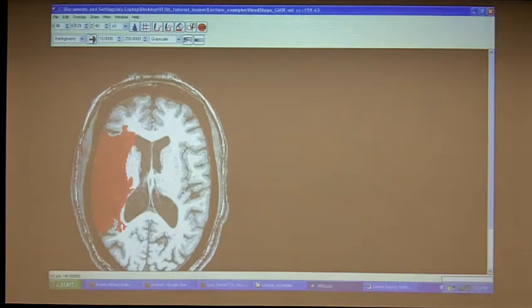But again, it really depends on how extensive the spidering Grant was talking about is in that lesion. If there's a lot of that, it could take you a day and a half. And that's straight work. You will go insane if you sit there for 12 hours straight looking at these things. Is that voxel damage? Because you have to do that around the edges. So it gets tedious. You want to have an iPod or something, or other work you can do, to take a break and do something else. You'll go blind. I clearly need a stronger prescription after.